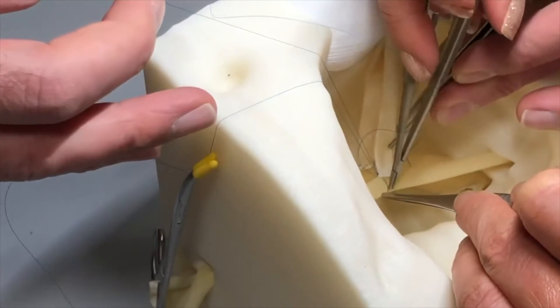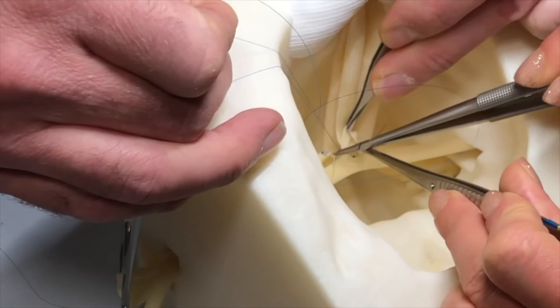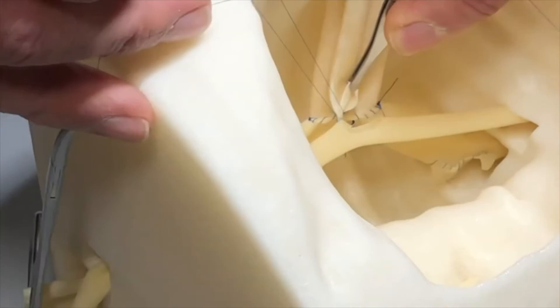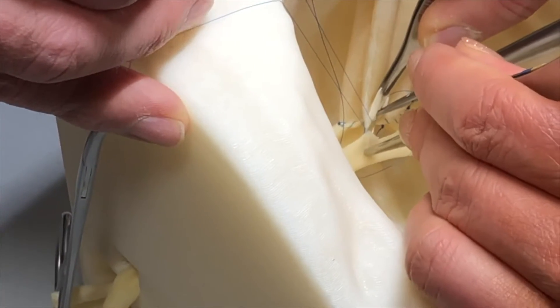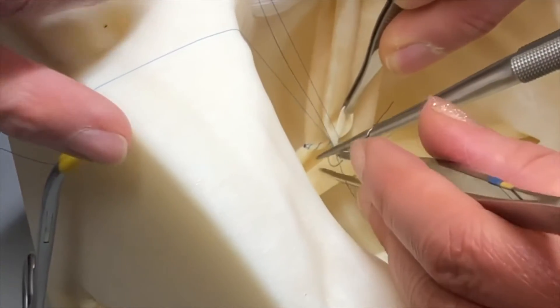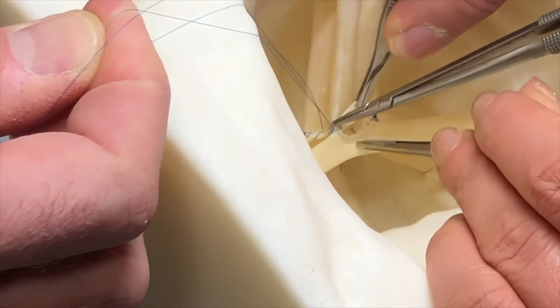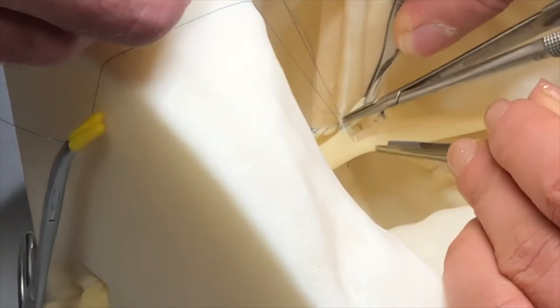I then take the suture and go behind my knot from the outside to in on the iliac artery. I find it is helpful to take these first two bites in two to ensure that your corners are secure and aligned properly. As I move down the artery, having a good assistant is crucial — they help hold up on the donor artery and align the anastomosis properly while providing the proper tension on the suture.